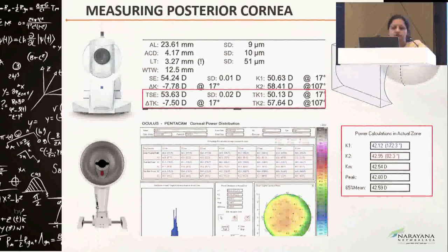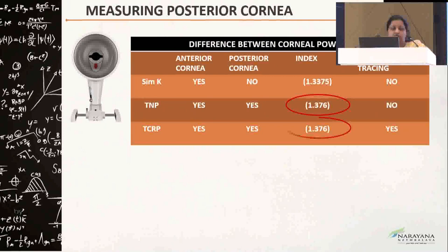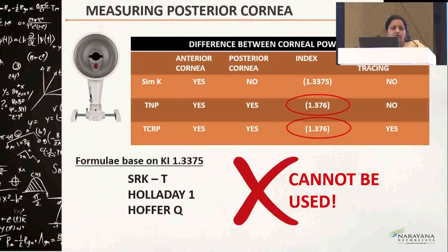Pentacam gives us different K readings. It gives us the Sim K. It gives us true net power, total corneal refractive power. Here we should note that Sim K is the only one which uses the refractive index of 1.3375 and so can be used in all older IOL calculations. Whereas the TNP and the TCRP are based on the actual corneal refractive index of 1.376 and therefore cannot be used.